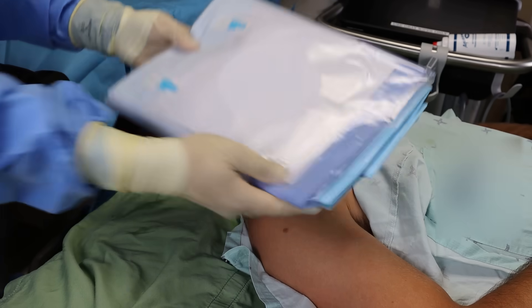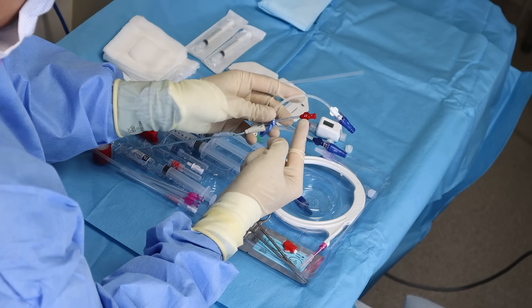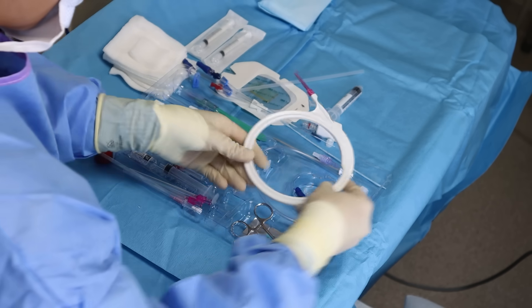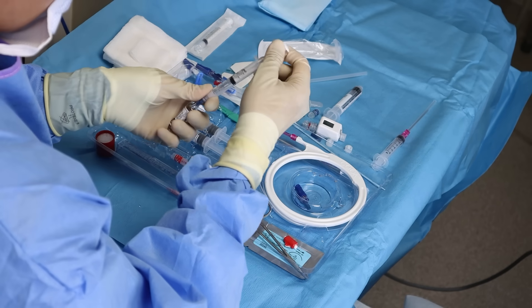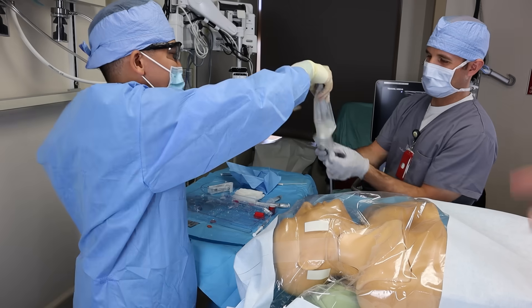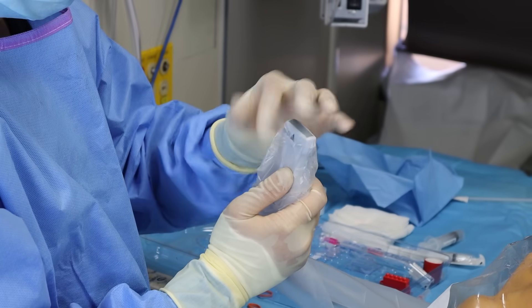Prep and drape in the usual sterile fashion. Make sure you orient the drape according to the arrows. We have to prime some of our equipment. Take the catheter and attach the blue caps to the two side ports. Leave the middle port uncapped because the wire will need to emerge from there. Flush each of the three ports generously with saline. Thumb the guide wire back and forth to ensure it glides smoothly, then leave the wire so it is just about to emerge from the cheater cone. Attach the finder needle to the syringe — I used the long one — and then draw up some lidocaine. Have your assistant put gel on the tip of the ultrasound probe while you ready the probe cover.